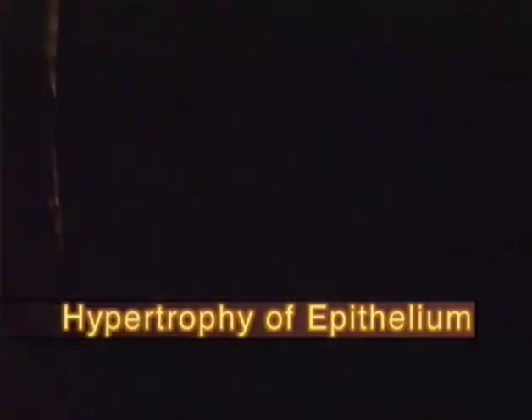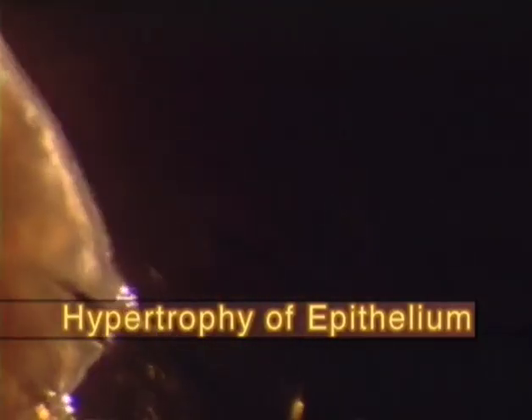In this case of hypertrophic epithelium and beginning papillary transformation, the optical section shows the thickened epithelium between the narrow light slit at the surface and the slit at the underlying tissue. The increase in thickness of the epithelium can also be revealed by observing the crest of the lid in retroillumination against the background of the globe.